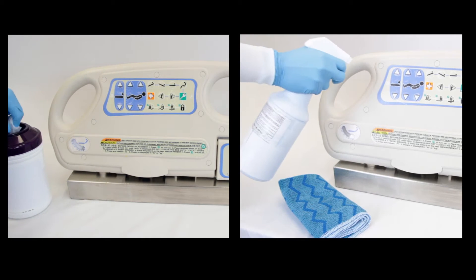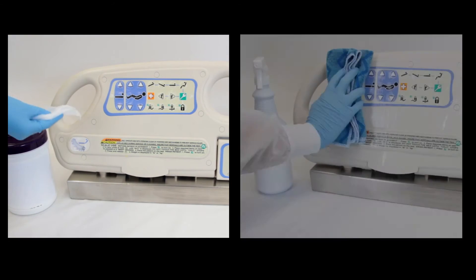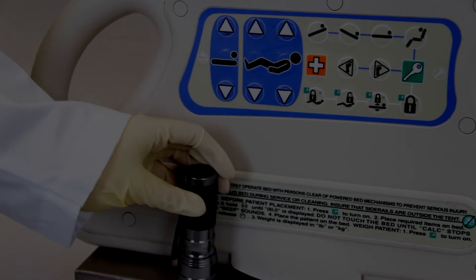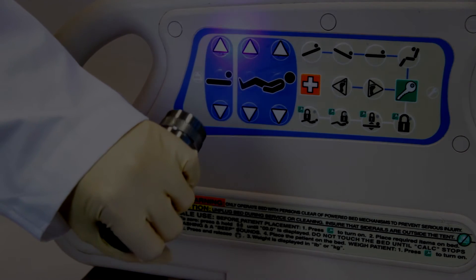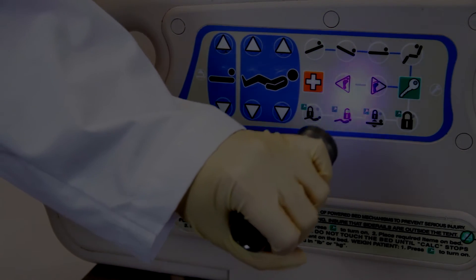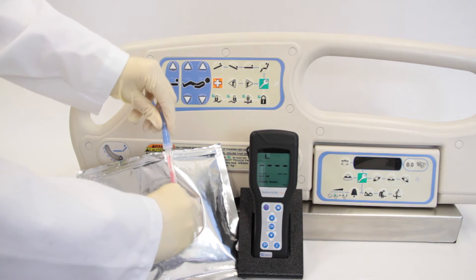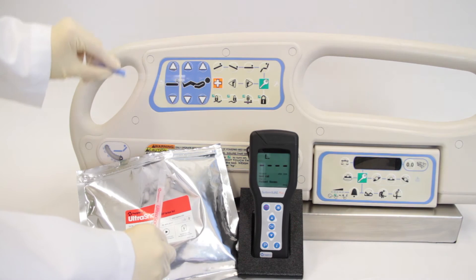In this demonstration, we've removed two different brands of fluorescent gel from the bedrail surface using common hospital-grade disinfectant spray and germicidal wipes. Even though fluorescent gel has been removed from the surface, that does not necessarily mean a surface or a room has been properly cleaned. ATP cleaning verification measures actual biological residue left behind on a surface after cleaning.